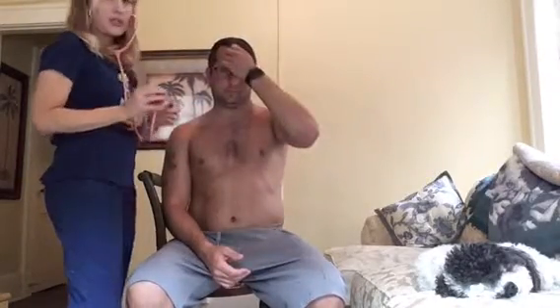And then I'll move to auscultation. With auscultation, we'll want to listen with the diaphragm of our stethoscope or the bell, whichever one you prefer, and we're listening for any type of abnormalities, any type of regurg or murmurs. No murmurs present.